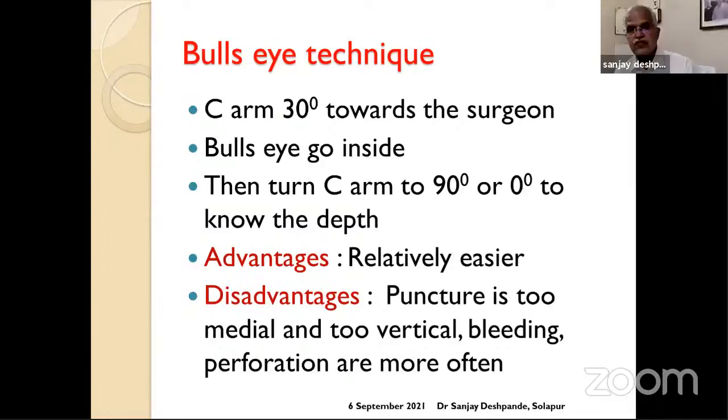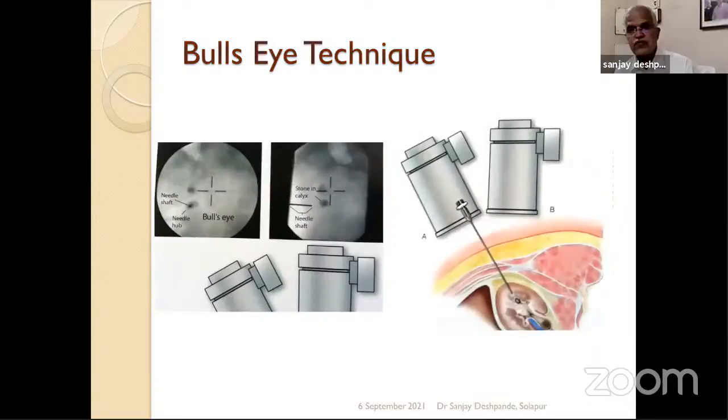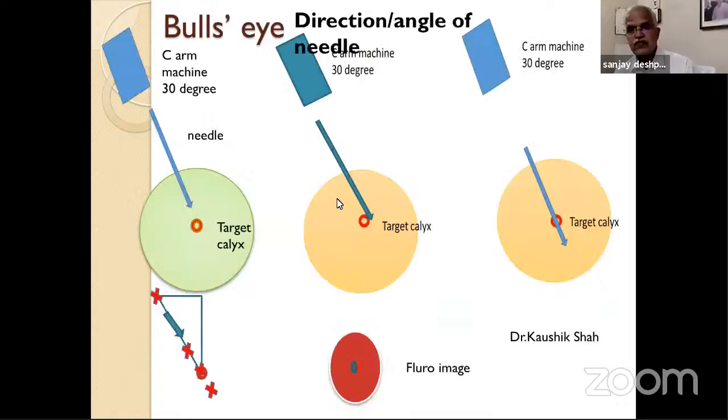Now this, I have to see, it is direction and direction. Now this is in 30 degrees. Now, whether you reach the place or not, if you are short, you will see this gap. If you hit the spot, you will be on the spot. If you have gone beyond the spot, your needle will have gone beyond. This you will see on 0 degree. So there will be no controversy.